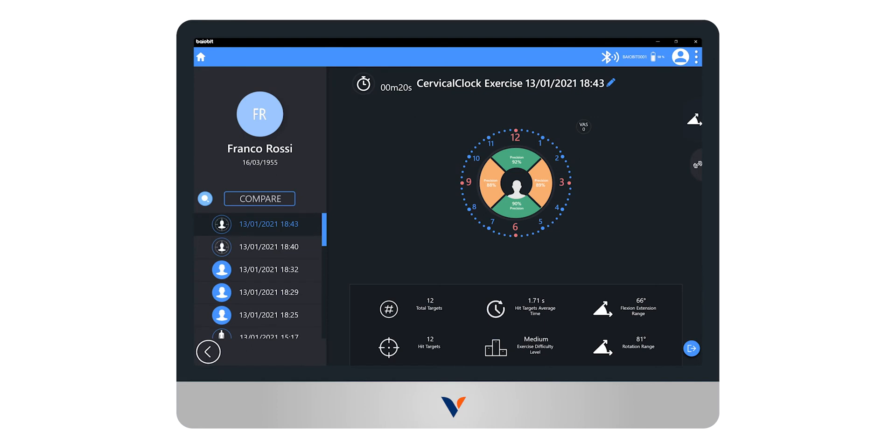The report page is then displayed, showing the maximum range of motion reached, the precision the patient was able to hit the proposed target, and the average time to hit each target.